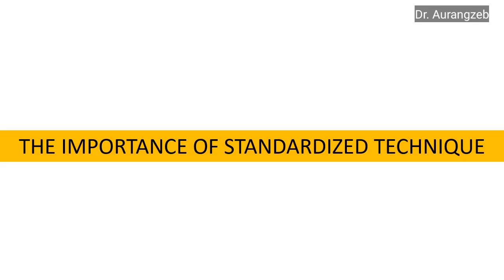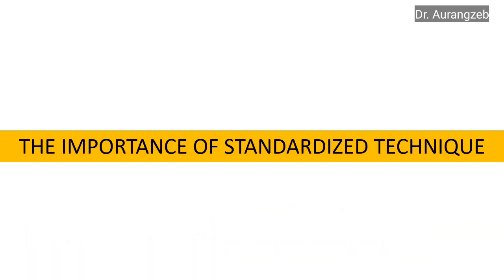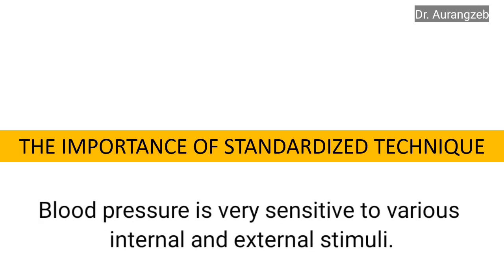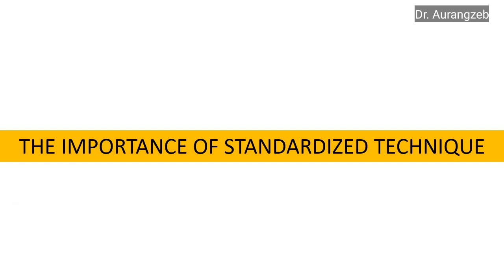What is the importance of standardized technique? We all know that blood pressure monitoring has been described as likely the clinical procedure of greatest importance that is performed in the sloppiest manner. Because blood pressure is a highly variable physiological parameter that is sensitive to numerous endogenous and exogenous stimuli, it must be performed meticulously with strict adherence to standardized technique.